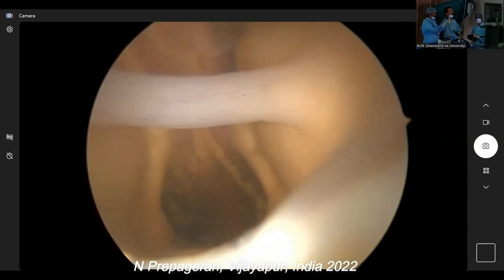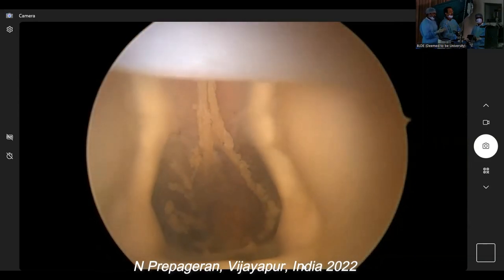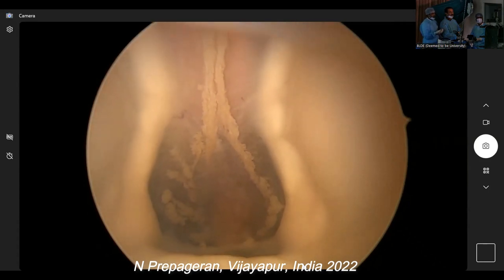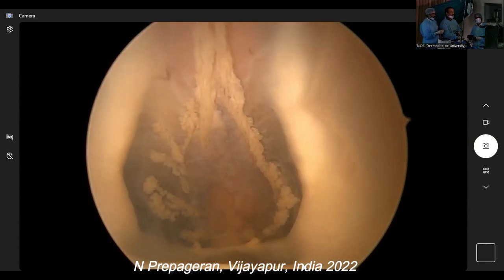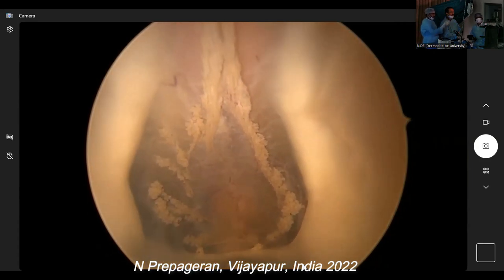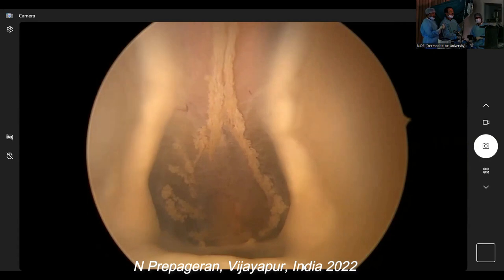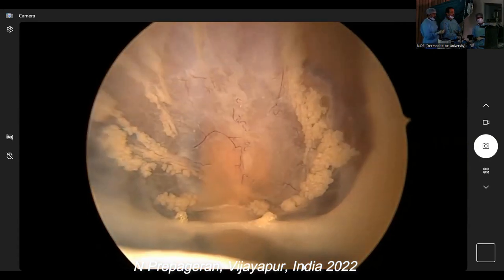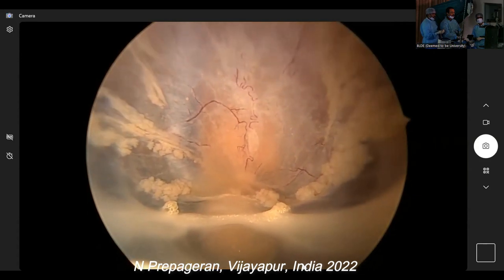Choroid plexus. Nice. Thank you, sir. Choroid plexus, beautifully. Very, very nice. Down here at 6 o'clock is the aqueduct of Sylvius. Up there is the foramen of Monro, on right and left. The aqueduct of Sylvius goes into the fourth ventricle here. Can you see? Yes, sir.